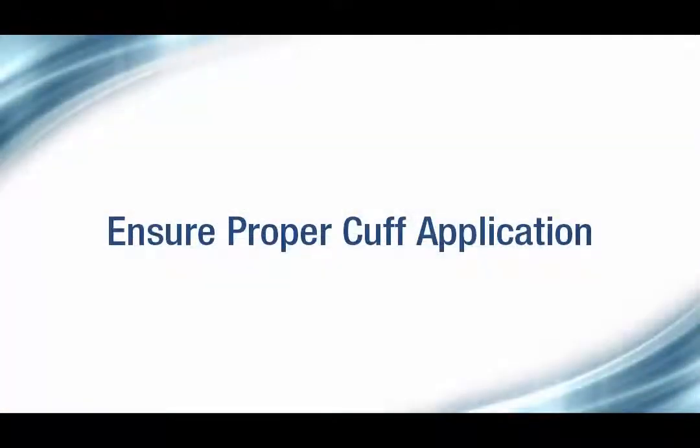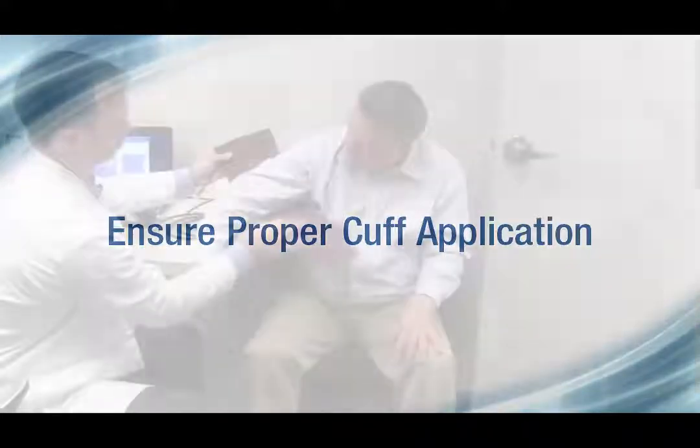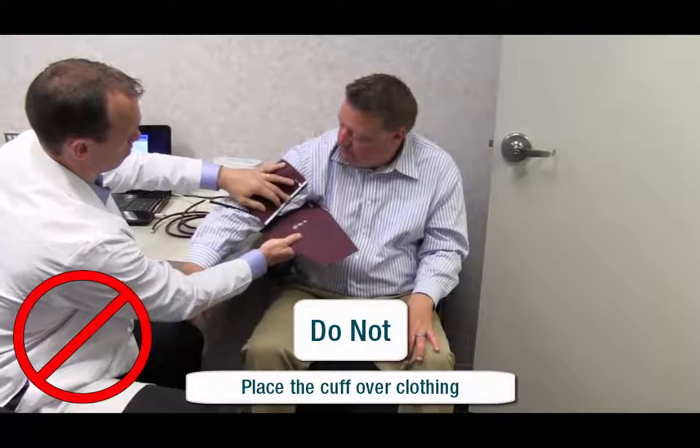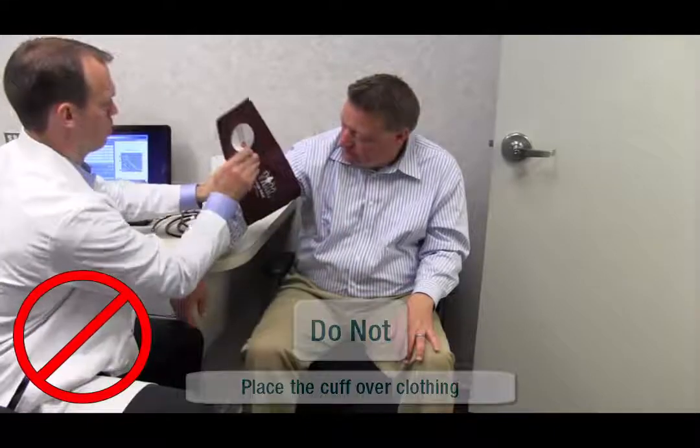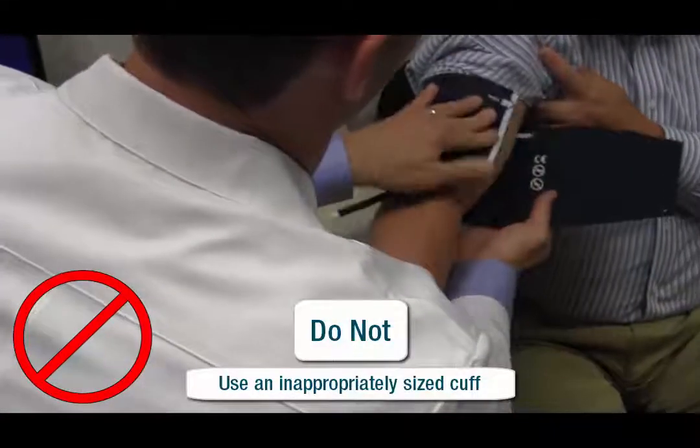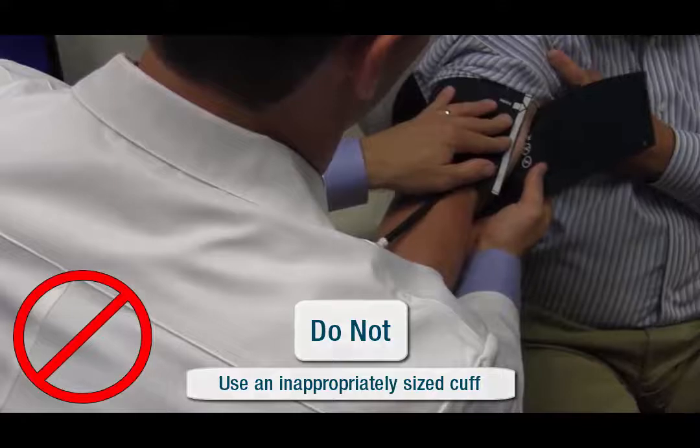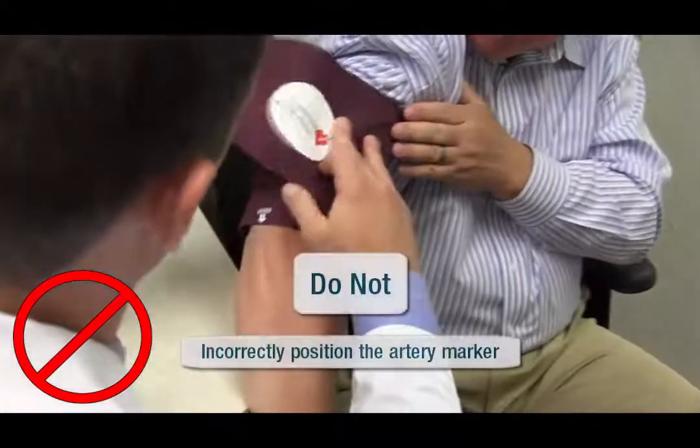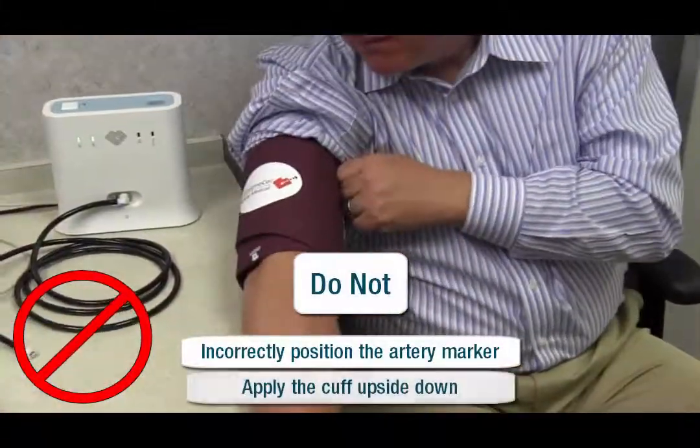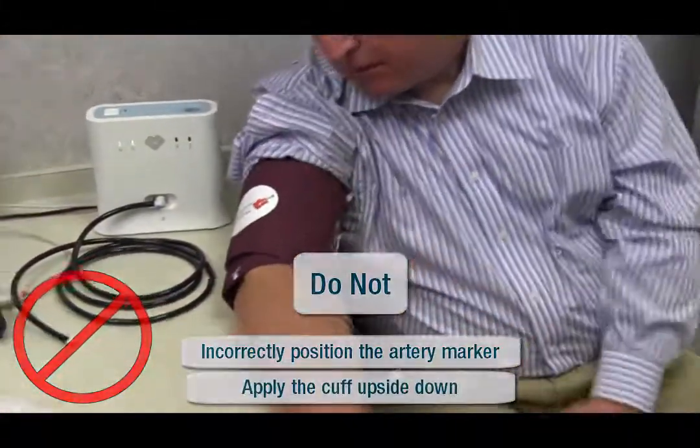It is important to ensure proper cuff application when performing pulse wave analysis. If done improperly, it may yield erroneous results. Take careful consideration to not place the cuff over clothing, use an inappropriately sized cuff, incorrectly position the artery marker, or apply the cuff upside down.